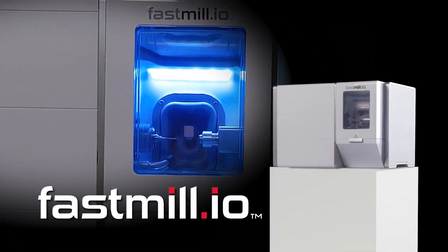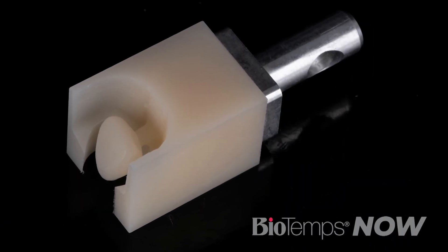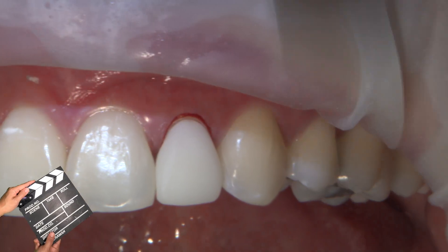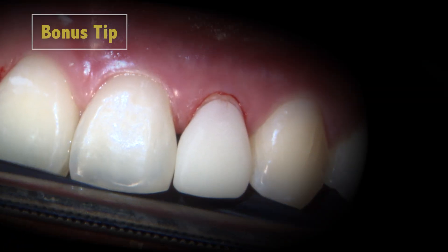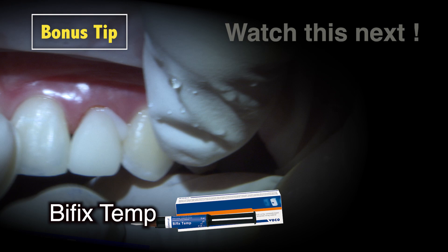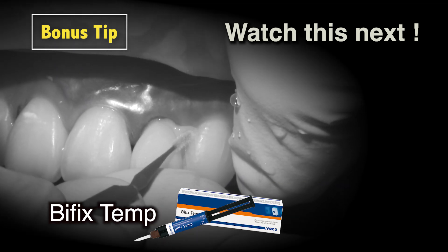Finally, I used my FastMill I.O. in-office mill to fabricate the BioTempsNow temporary crown chairside in just a few minutes. Properly fitted BioTempsNow provisionals allow the soft tissue to heal to the shape of the accurate margin. After try-in and occlusal bite check, I cemented the temporary with Bifix Temp, a dual-curing composite-based temporary cement from VocoAmerica, which offers high aesthetics and simple application.